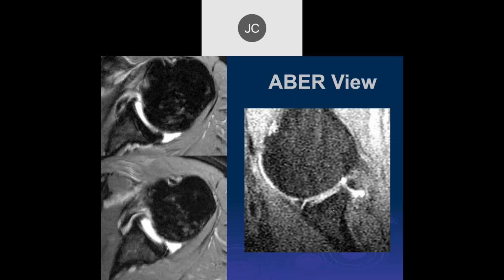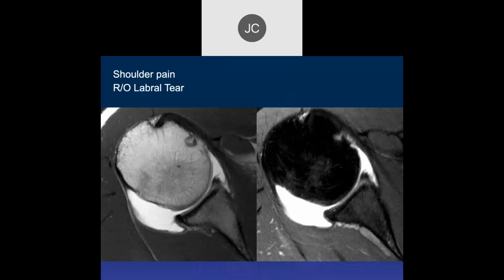But there are a number of people who are really trying to push sports medicine who like to do these and really feel that they're important. We found that it really impacted the diagnosis only about 1% of the time in the study that we did, which in 200 patients is not very many patients. So I felt that it's rare that it was actually worth spending the time and effort to do that imaging. But there are a number of people who would disagree with me.